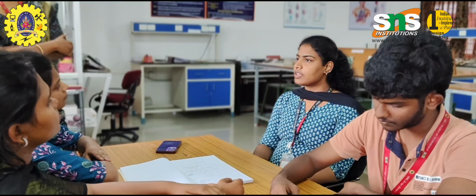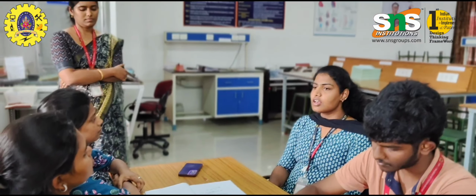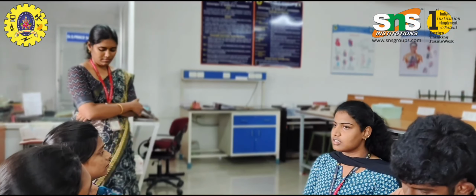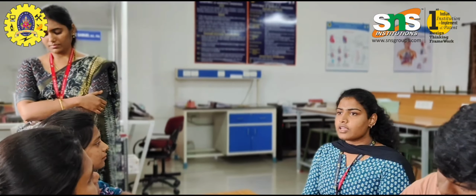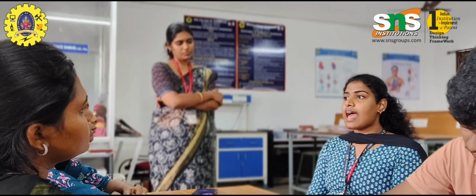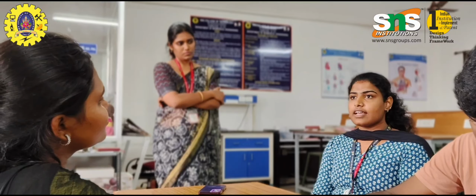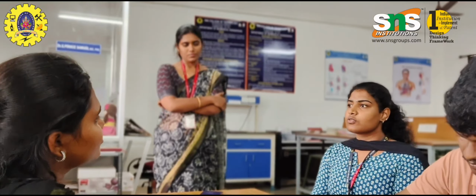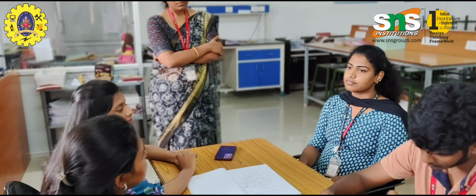So I think bipolar ESU is used for precise surgeries and to ensure safety, because once in a cosmetic surgery unit, the monopolar ESU caused a fire accident in the operation theatre because the alcohol-based prep solution was not fully evaporated and the active electrode ignited the vapors. It caused burns in the patients and damage to the instruments. So bipolar is considered better than monopolar ESUs.